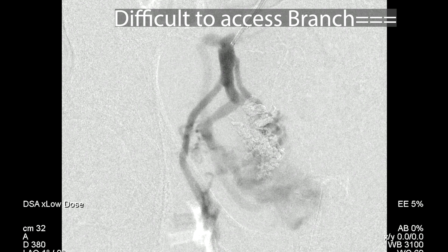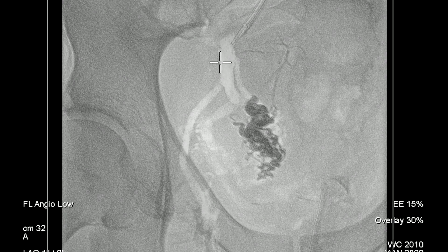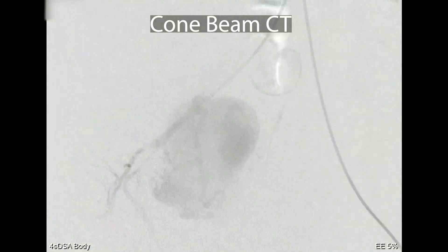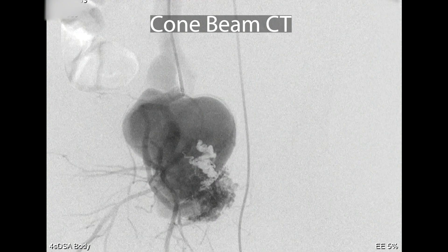You've got to change something — either reshape the wire or change the microcatheter, since there are a number of different shapes available. We pulled the sheath back a little bit. We ended up doing cone beam CT, which we probably should have done right off the bat. That lets you get every angle you could possibly want and really optimize where the optimal takeoff view actually is.